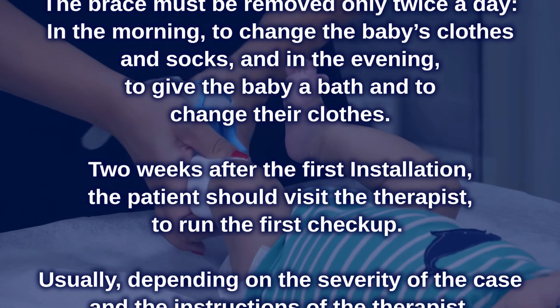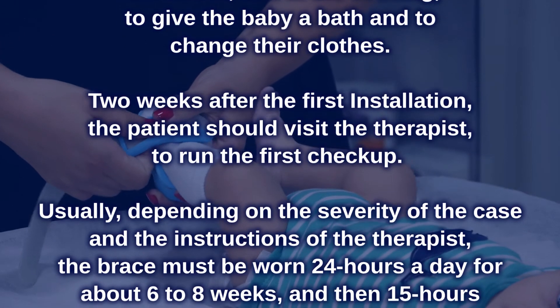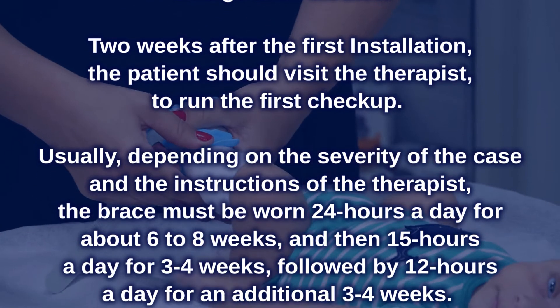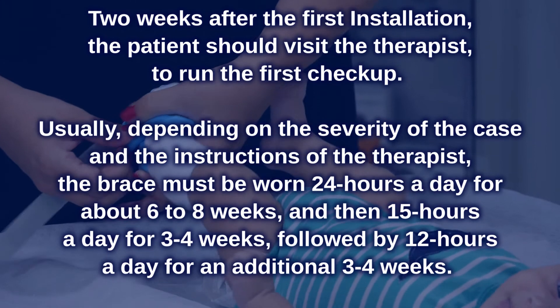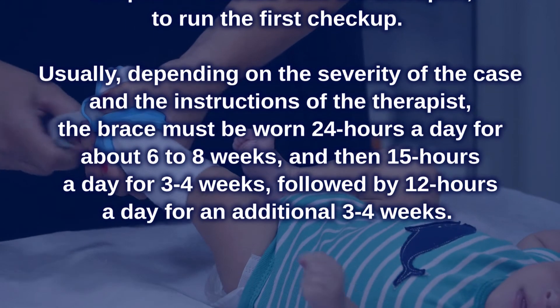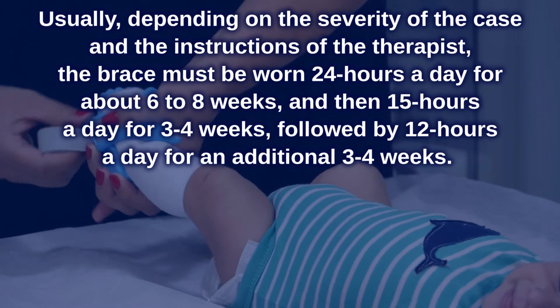Two weeks after the first installation, the patient should visit the therapist to run the first checkup. Usually, depending on the severity of the case and the therapist's instructions, the brace must be worn 24 hours a day for about 6 to 8 weeks, then 15 hours a day for 3 to 4 weeks, followed by 12 hours a day for an additional 3 to 4 weeks.